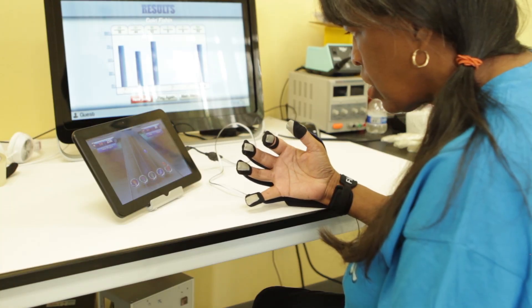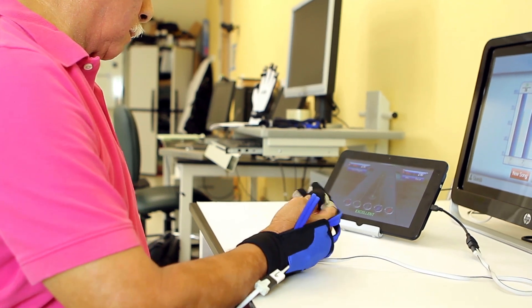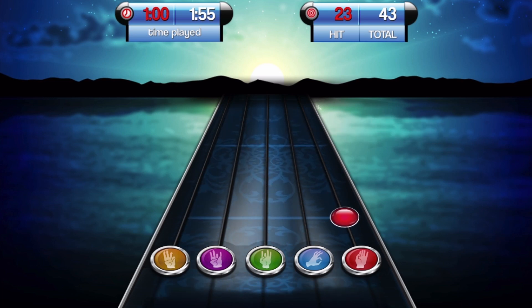In traditional rehab, you actually get a pamphlet of exercises to do at home. Music Glove is more interactive — it's actually giving you direct feedback on your performance. It gives you motivation to do the task, the patient has the ability to do it more frequently, and in addition, it gives them access to therapy which they might not have had before.